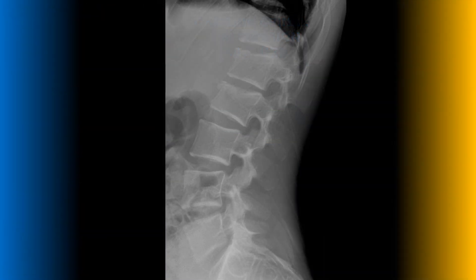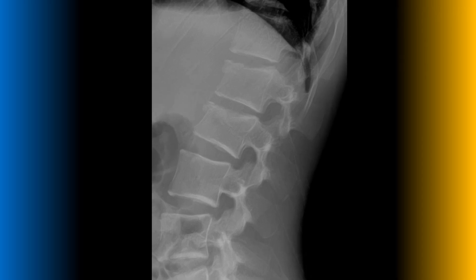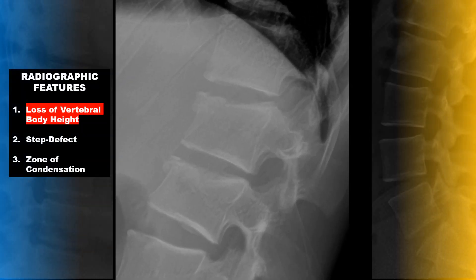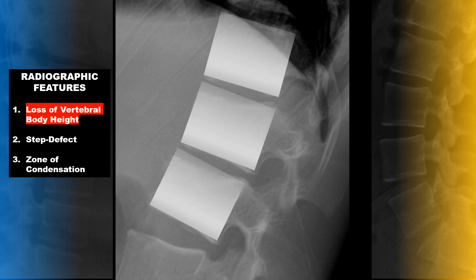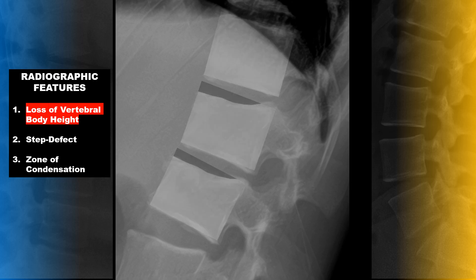Here's an example of multiple spinal compression fractures. The key radiographic appearance is a loss of vertebral body height seen on the lateral view. If you look at the normal squared appearance of the vertebral body and then the loss of anterior vertebral body height in comparison to the posterior vertebral body, you should be able to spot this.